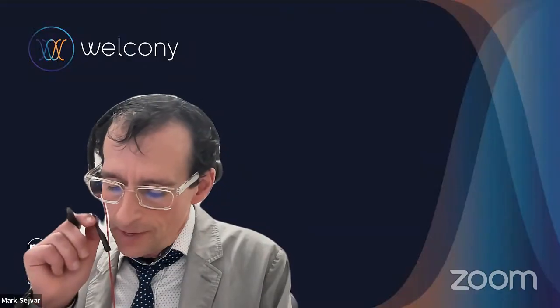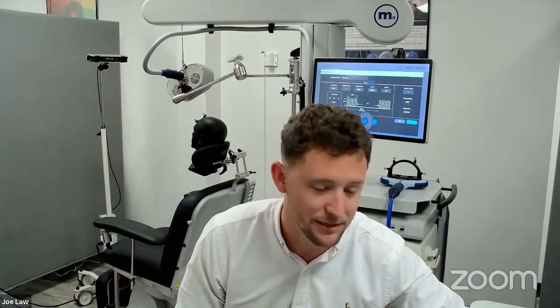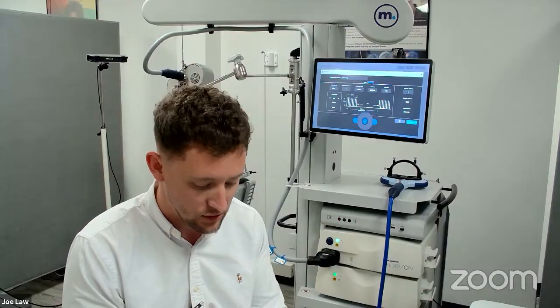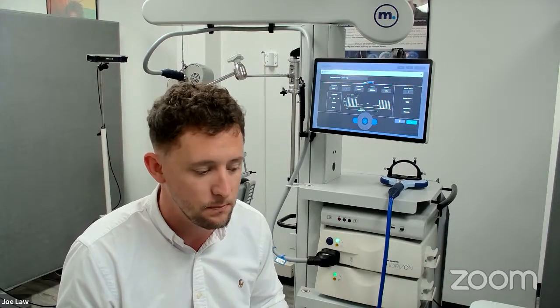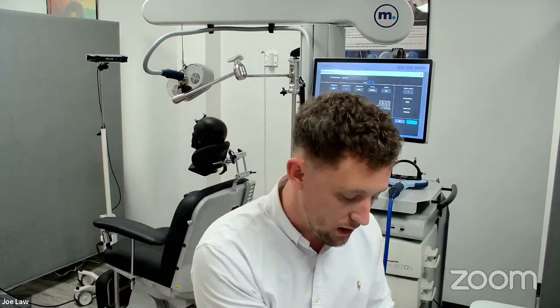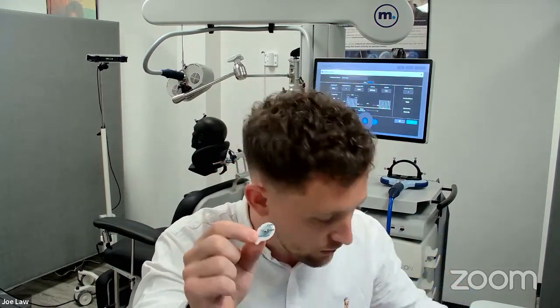Great. Another question. What kind of ongoing fees are involved with operating a Magstim system? Great question. Something I'm actually very passionate about, Magstim is not pay-per-use. So it's something we're strongly against here. It's not a pay-per-use system. We're not subscription-based. For full transparency here, the only disposable items needed for this device are generic EMG, EKG electrodes.